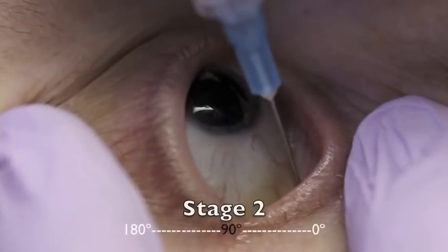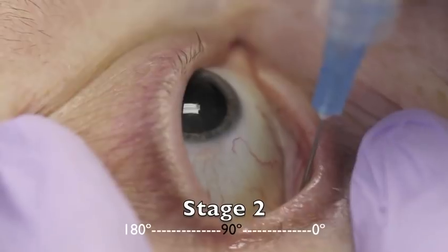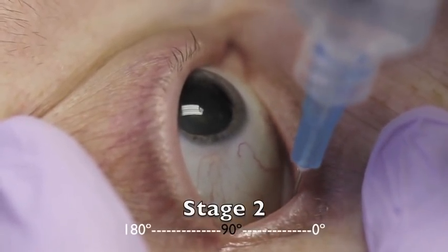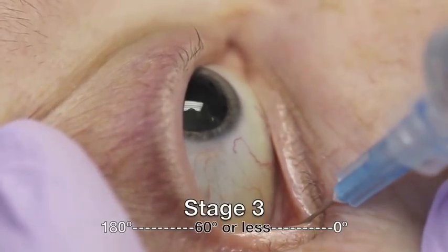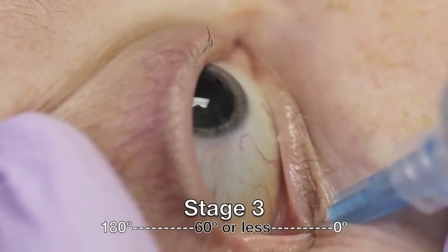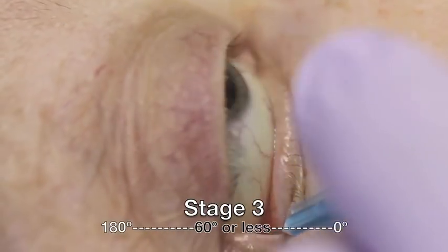Stage 2: redirect 90 degrees. Slowly advance the needle tip posterior half an inch, passing the equatorial plane of the globe in the extraconal space. Stage 3: rotate the needle tip cephalad until the shaft of the needle rests on the infraorbital rim, then slowly advance the needle tip into the intraconal space to a depth of approximately 1 inch.